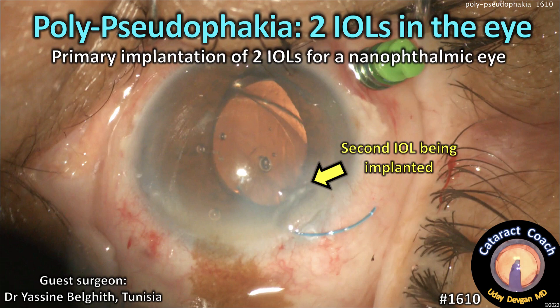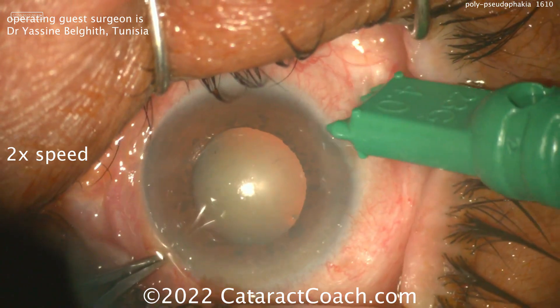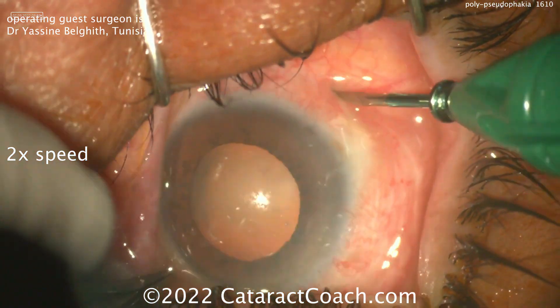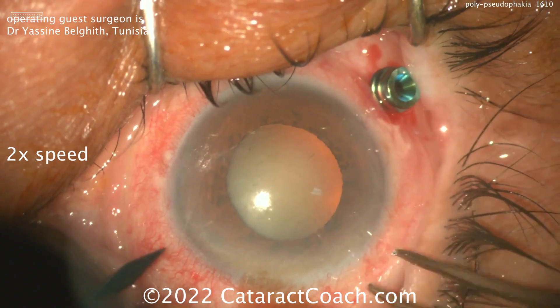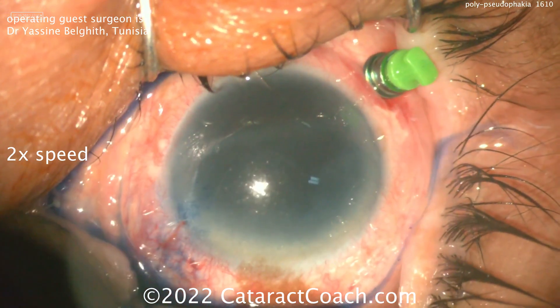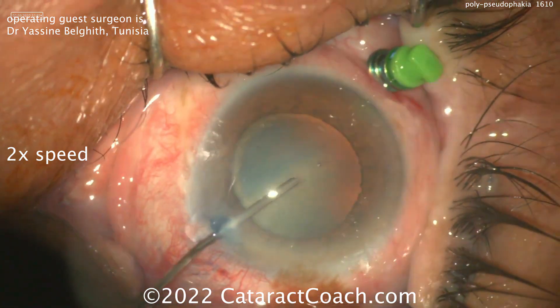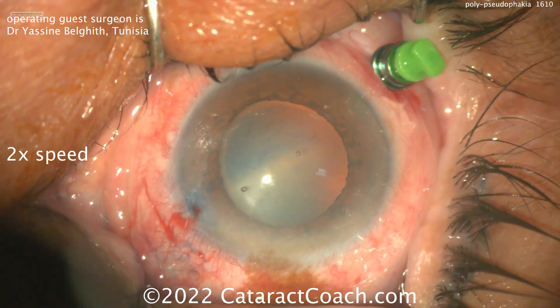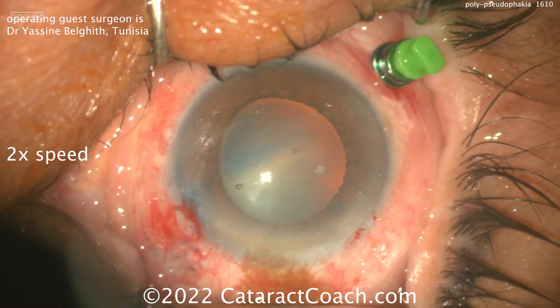Cataractcoach.com: polypseudophagia — that means two IOLs in the same eye. This patient is nanophthalmic, so look how small that eye is. The anterior chamber depth is shallow, axial length less than 16 millimeters, which calls for a more than 50-diopter IOL. The surgeon does a good job placing a trocar in the pars plana, but in a 16-millimeter axial length eye, where exactly is the pars plana? Do you place the trocar two, two-and-a-half, three, or three-and-a-half millimeters back? How do you know without damaging or puncturing the retina?